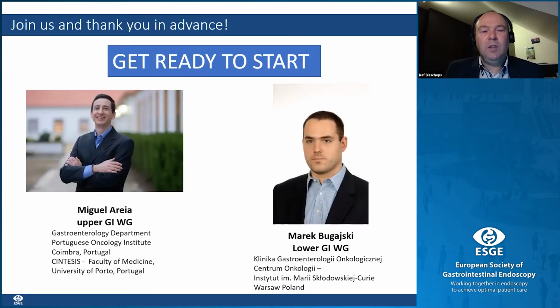It's my pleasure to introduce to you Miguel Areia and Marek Bugajski, who will show you how to use the upper and lower GI QIC app.